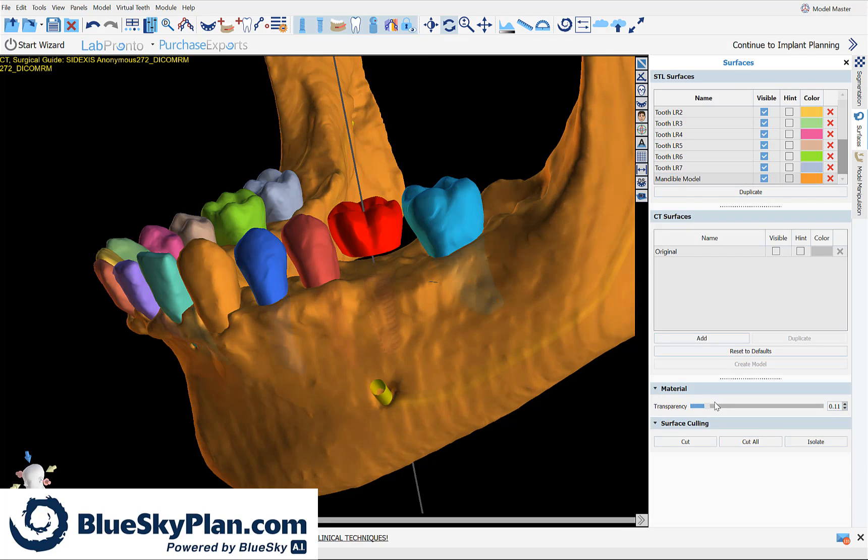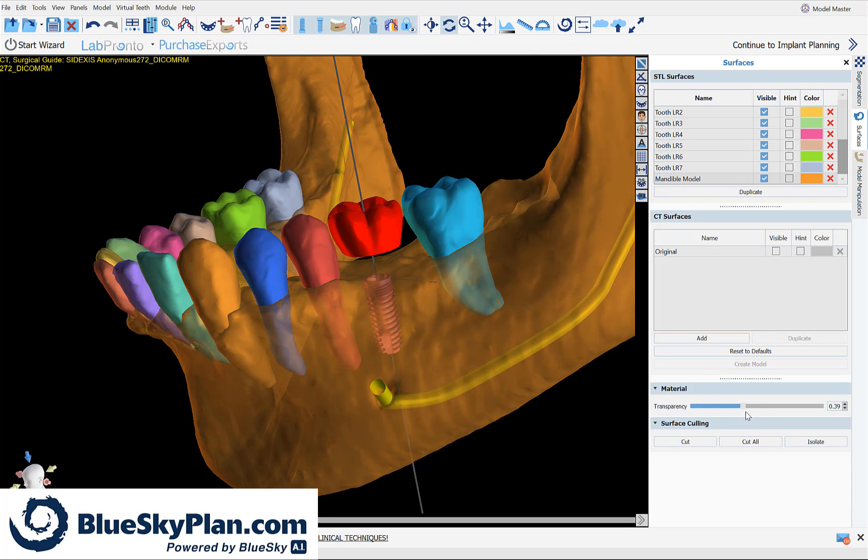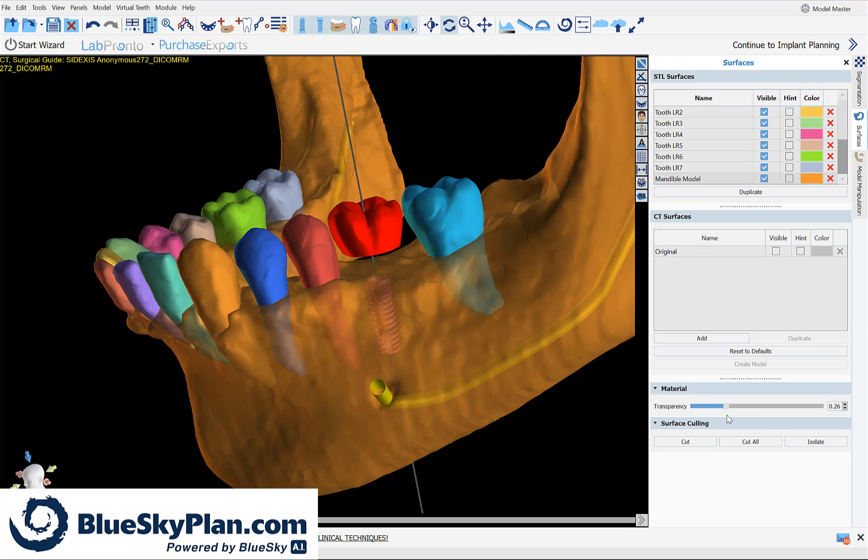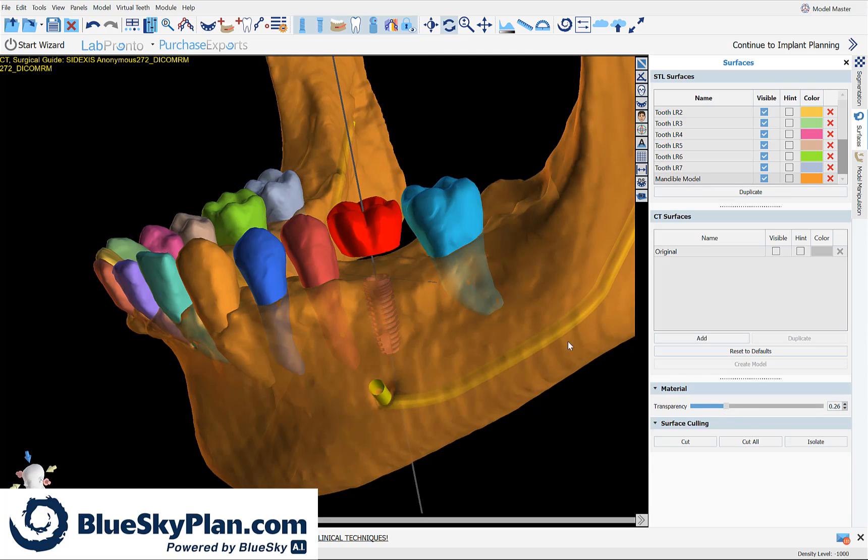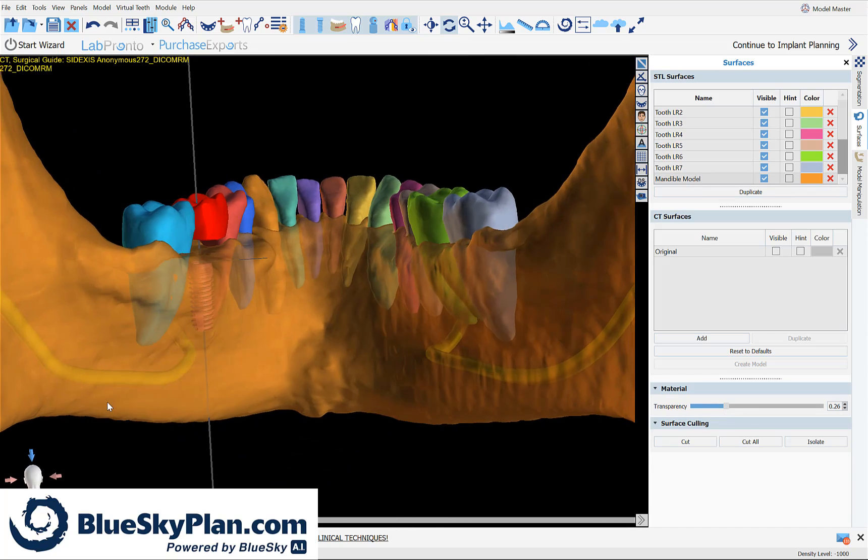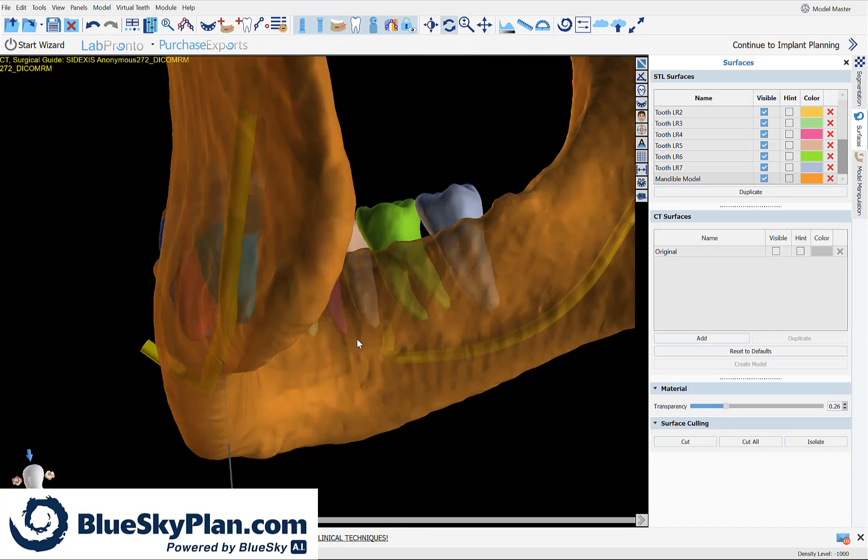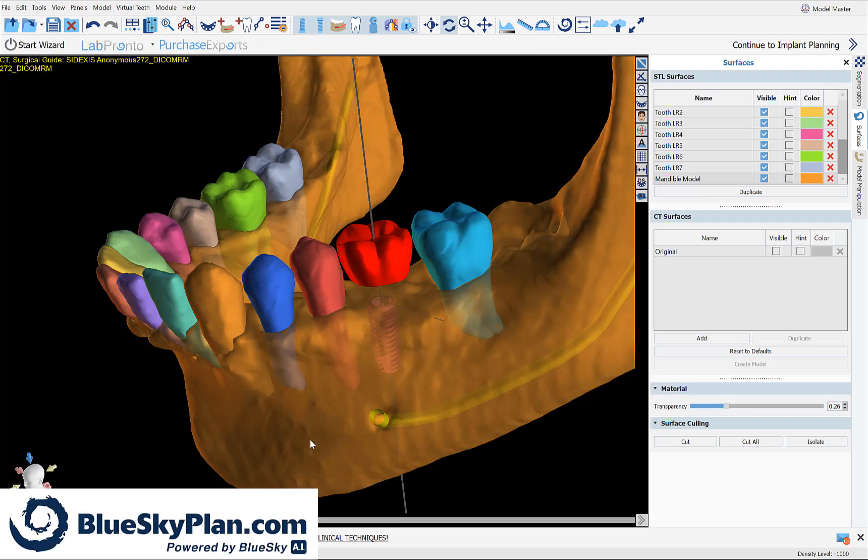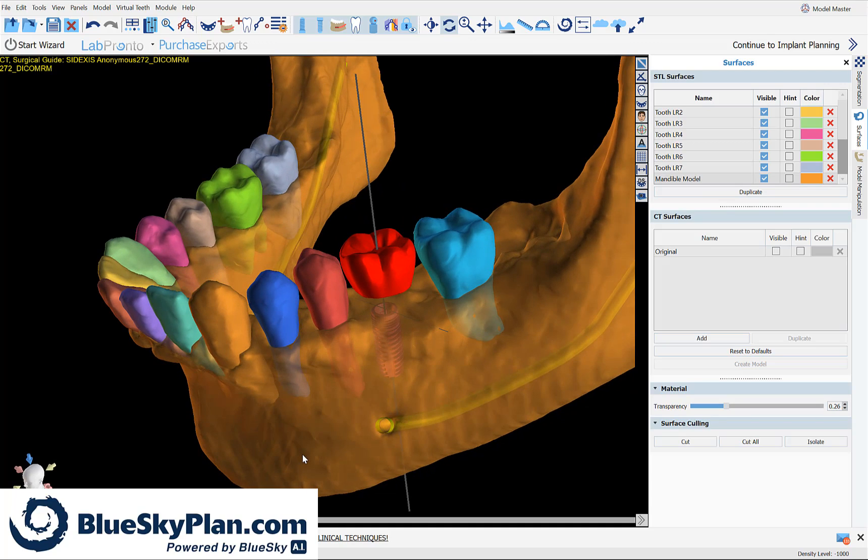We could select the surface, change the transparency, and here we could see our implant placed in the automatically segmented bone in relation to the automatically segmented CT teeth.